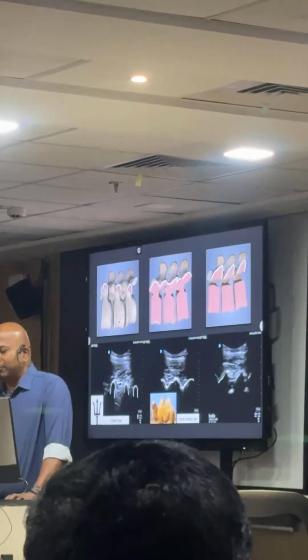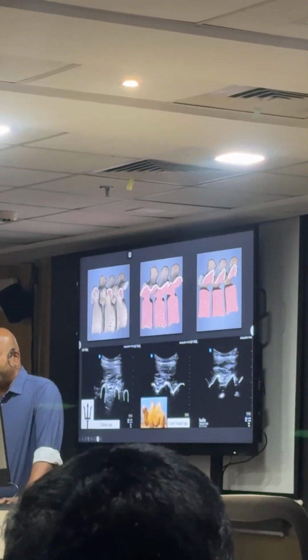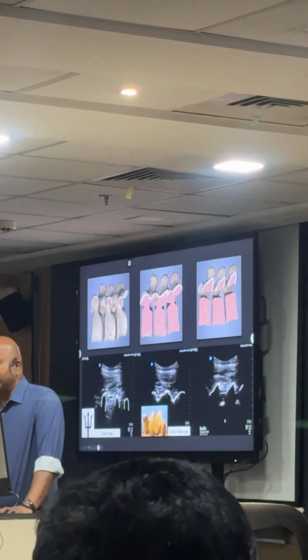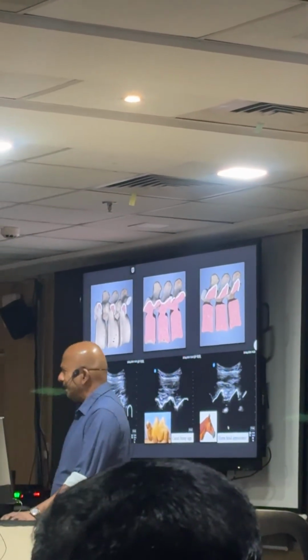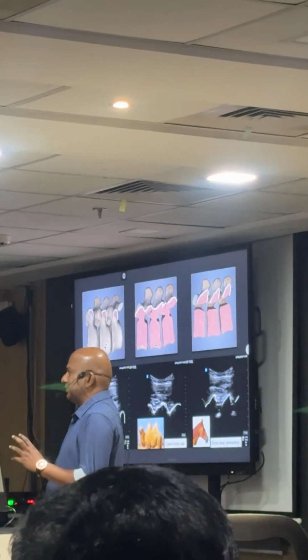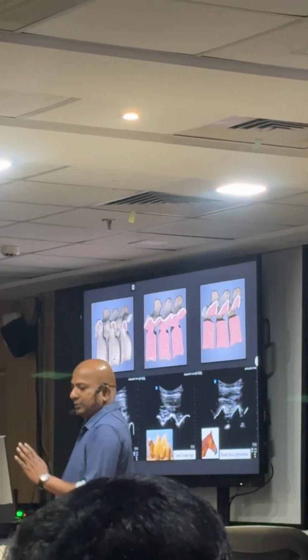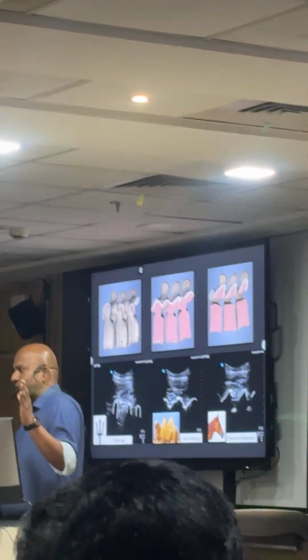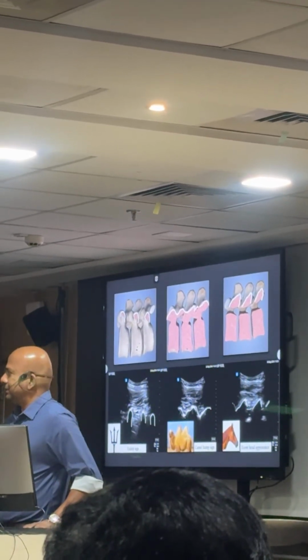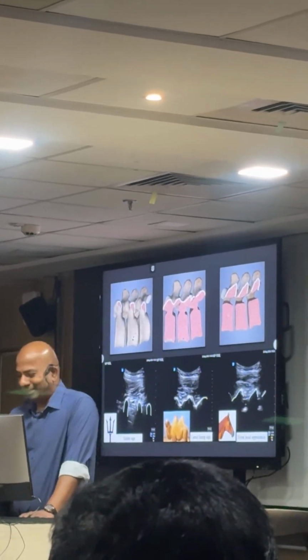And from there, if you make an oblique tilt, you see this continuous line has again become an intermittent line. And in between the two ramps, you can see the central neuraxis. This is where you will see the spinal cord. Since it looks like the head of a horse, they called it a horse-head appearance. So these three signs or pattern recognitions, you need to relate to these three views. One is trident, that is the transverse process view; camel hump, that is the articular process view; and then horse-head appearance, that is the interlaminar view. Are you with me? Okay.